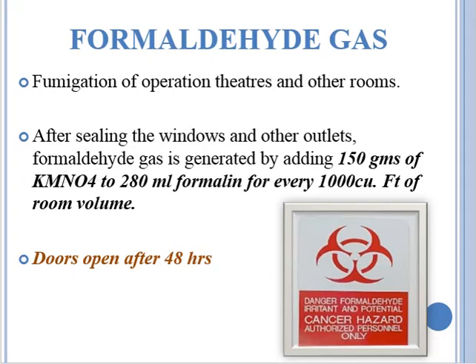So this is all about sterilization, different methods of sterilization and different articles which are used in sterilization. So basically, this topic is mainly for MCQ type and short SEQs.